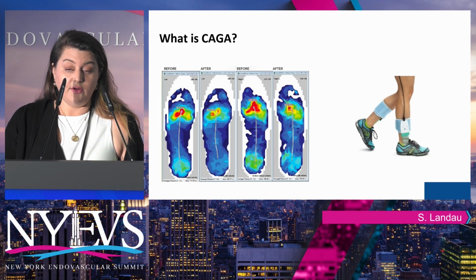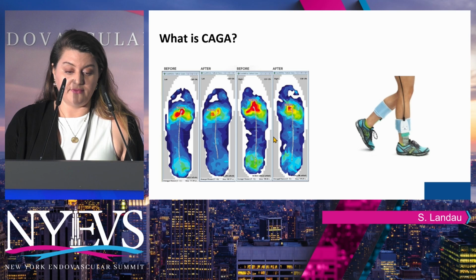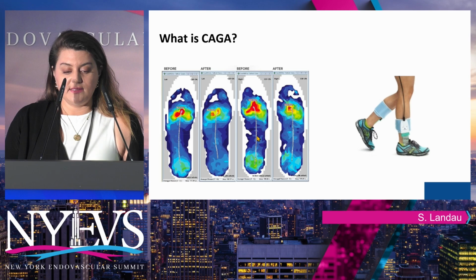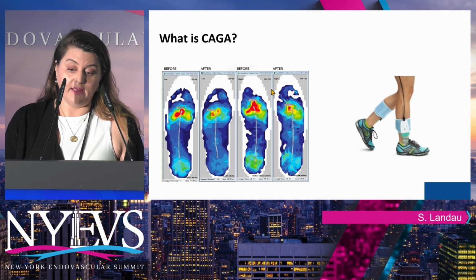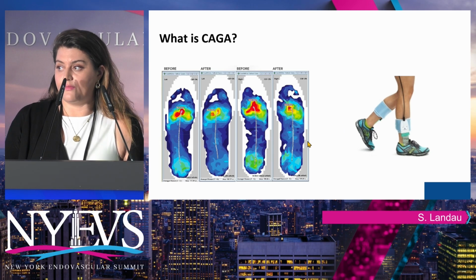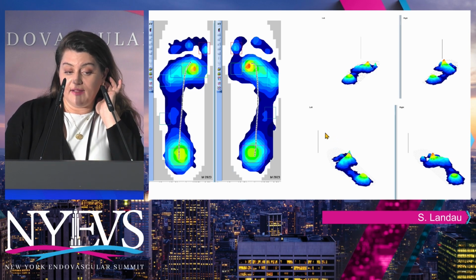Similar to the stiletto heel, the more surface area contact the foot has, the better it's going to perform. And you don't want this line to be going too far in. You want it to be somewhere middle and representative of what the body weight is doing during the gait cycle. But you can see left compared to left, right compared to right, it did improve with the use of the orthoses. So this foot right here is mine.